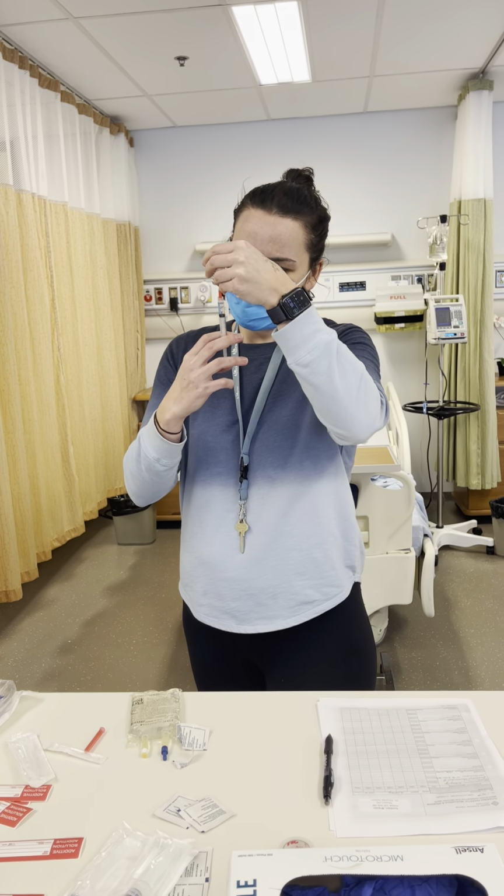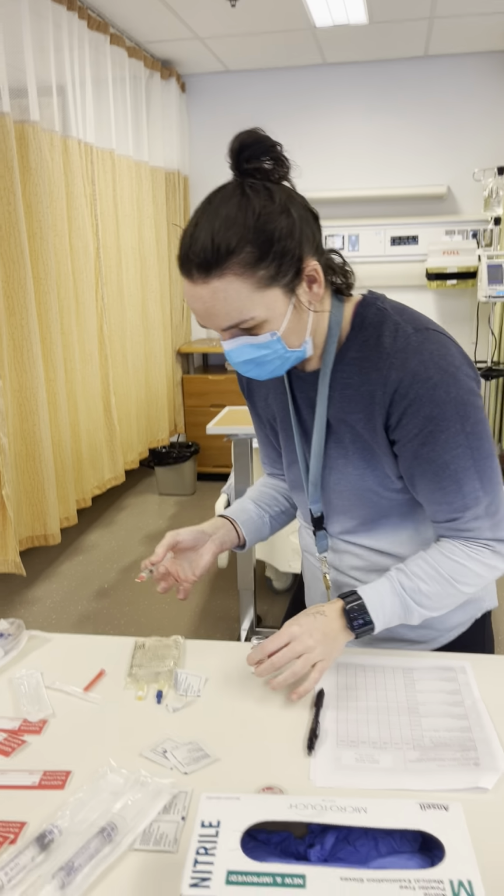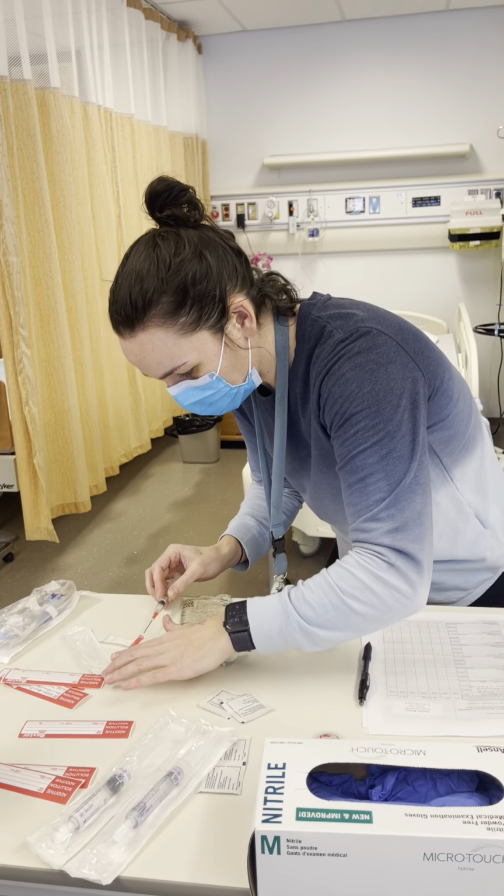Make sure we have 1 ml. Perfect. We'll scoop.